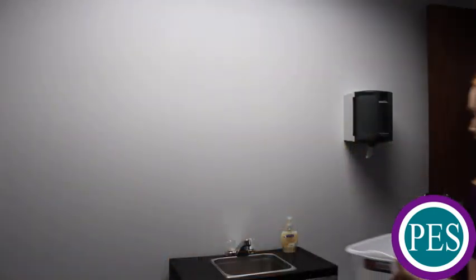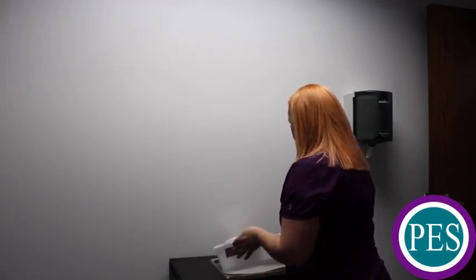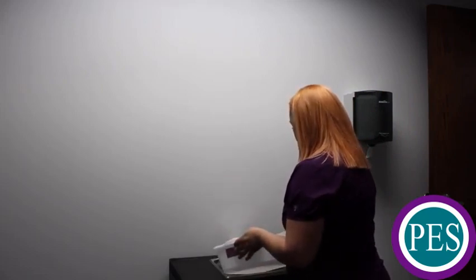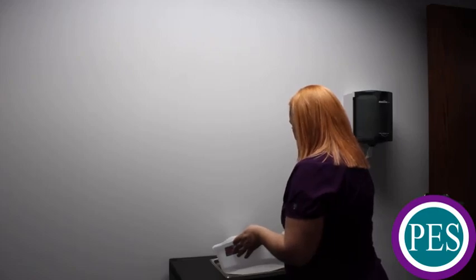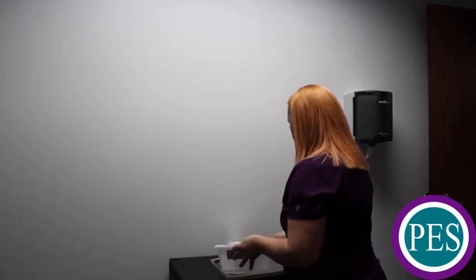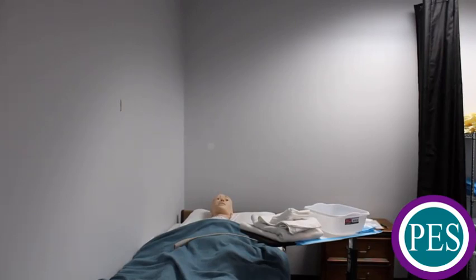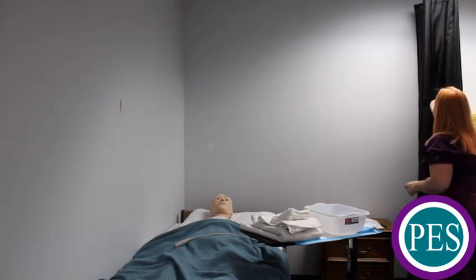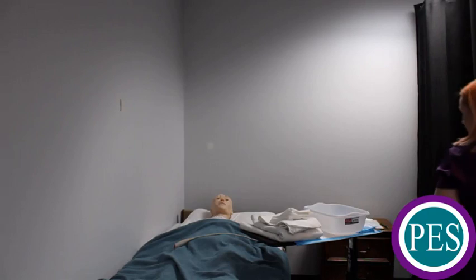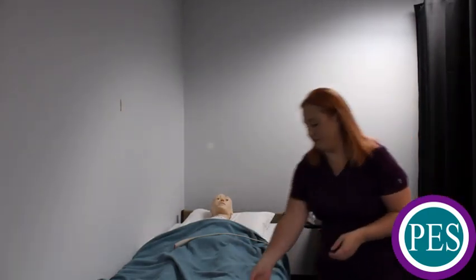Fill the basin with comfortably warm water. Be sure the wheels of the bed are locked and raise the bed height.